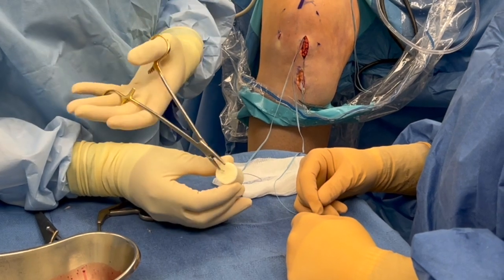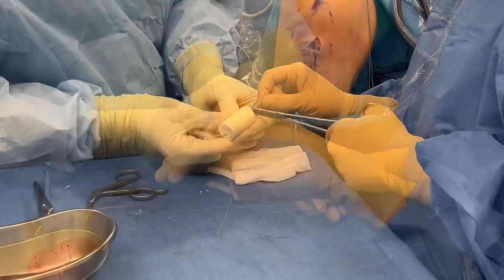You do not want to come out wide — we were a little bit wide, and now we're more centered. We're going to pull it through and then repeat this again.